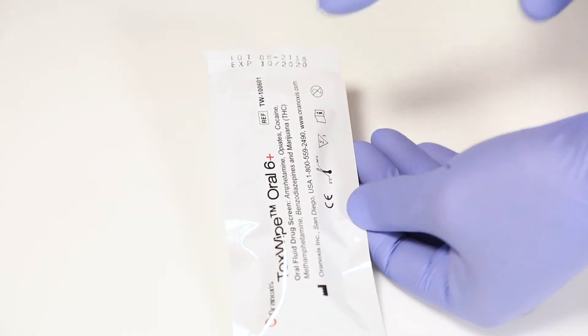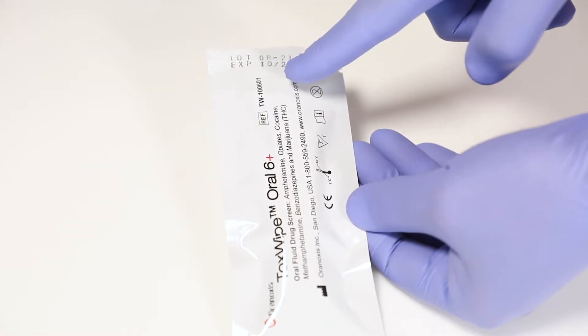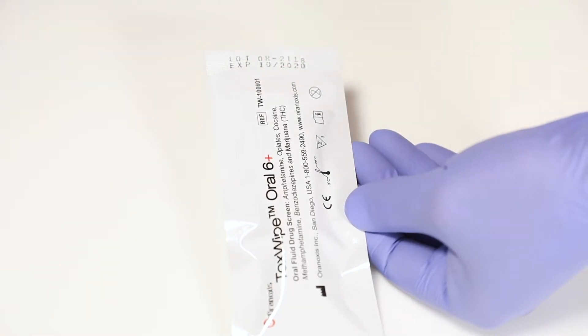First, check the expiration date printed on the pouch of your device. Any expired tests should not be used and should be disposed of.